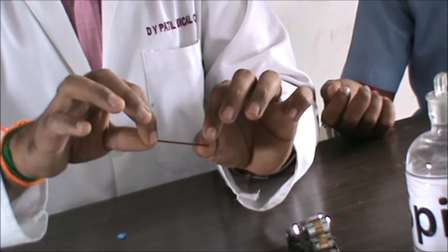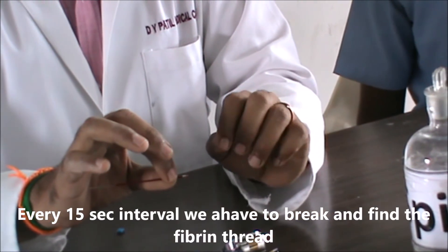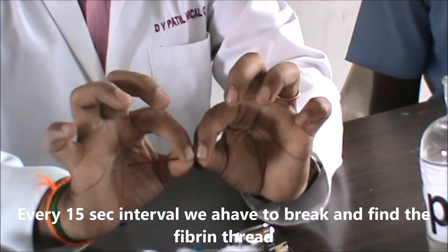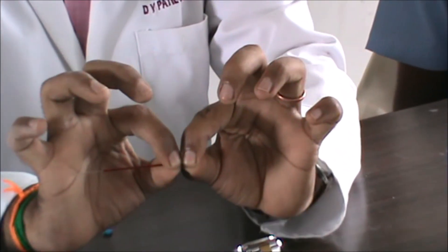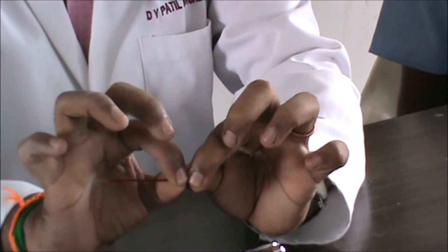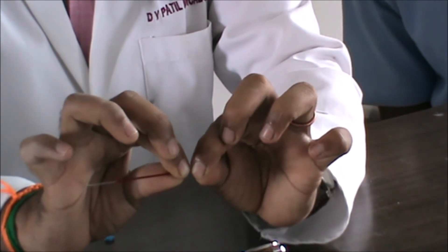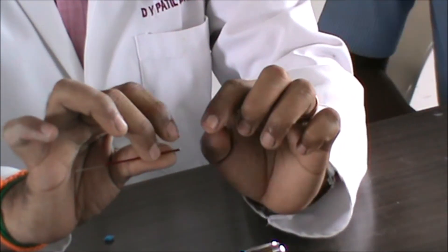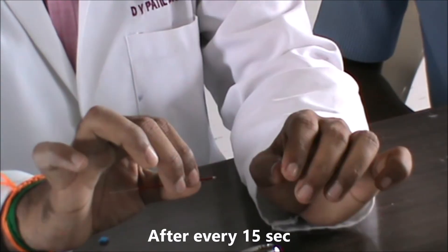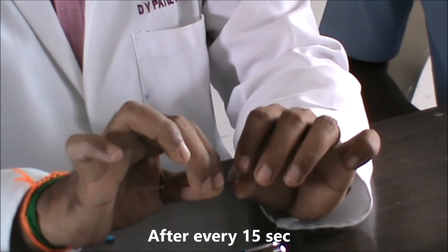After one minute, I am going to start breaking my capillary tube. You have to hold the tube like this and break it. Check whether a fibrin thread has formed or not. If not, wait and then break again. Every 15 seconds you break the tube and check whether the fibrin thread has formed.